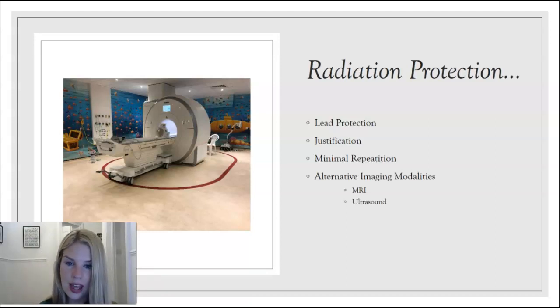You also have to make sure that the x-ray requests are aligning with your policies and your protocols within your department. You also want to do minimal repetition of x-rays, so you want to make sure that you're not just repeating things for the sake of it, and that's obviously the same in adults as well, but more important in paediatrics. Don't just repeat something because you think, well, it's not perfect. Does it answer the question? If in doubt, you would check with a radiologist. I know this isn't perfect, but can you see what you need to see? They might say, no, repeat it, or they might say, yeah, I can see what I need to see, so you don't have to repeat it.